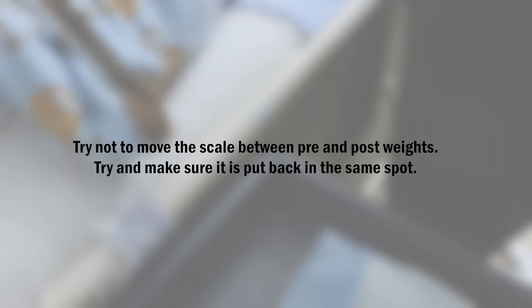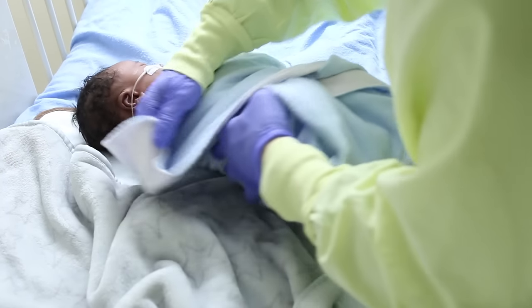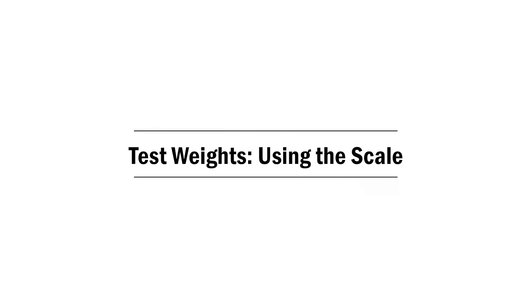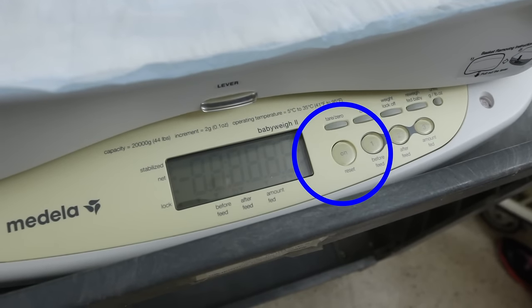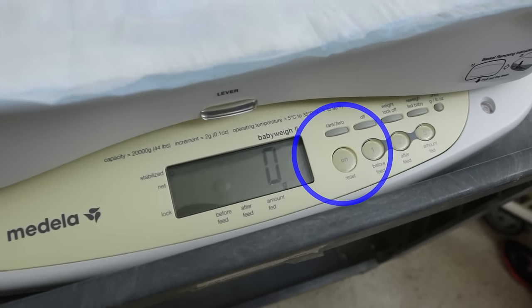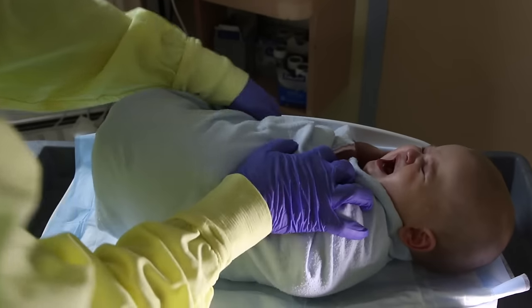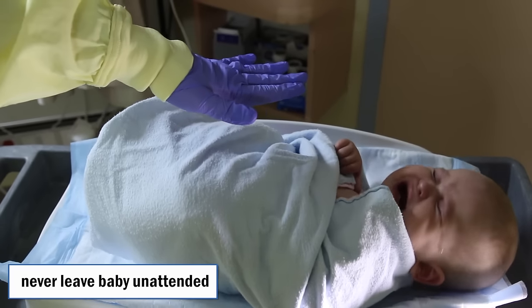If possible, try not to move the scale between pre and post weights; otherwise, just try to make sure it is placed back in the same spot. Swaddle the baby in a blanket to reduce movement. Turn on the scale and wait for the beep when the zero appears on the screen. Place the baby on the scale, ensuring that no part of the blanket is hanging over the side of the scale. Keep your hand hovering over the baby.